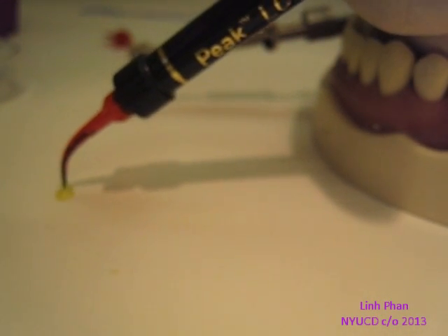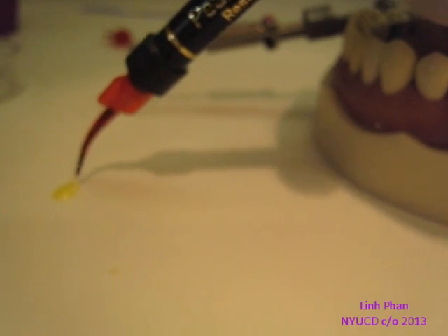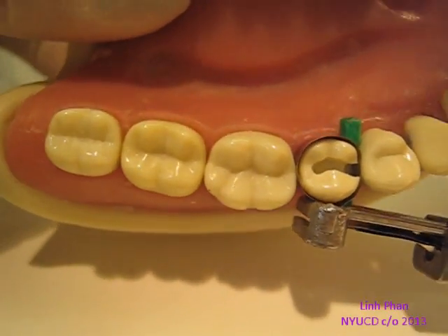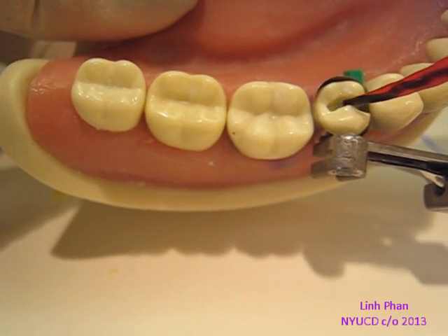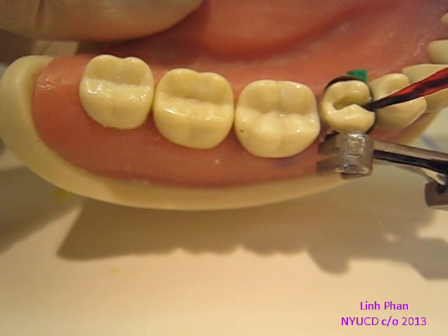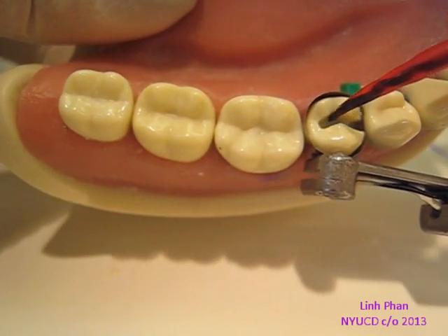When you take your bond, I usually put a little extra on the table so that way you don't get a big glob — you can kind of take it off. And then you brush the inside of it. You want to brush and make sure you get everything, and you don't want to put too thick of a coat. So all the walls — try not to get it on the surface of the tooth because it'll make other things thick. Just make sure you get everything.